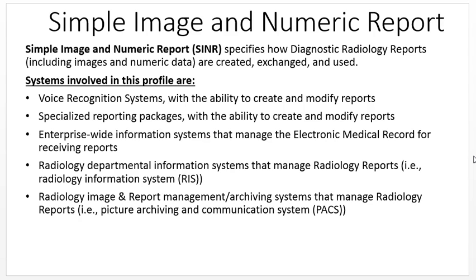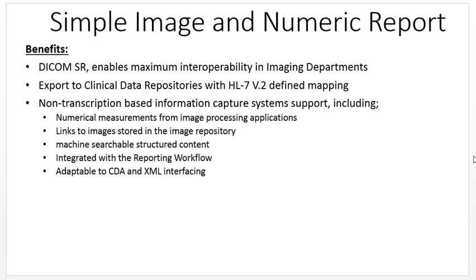Simple image and numeric report defines how diagnostic radiology reports, including images and numeric data, are created, exchanged, and used. Here are the benefits for the simple image and numeric report profile. DICOM SR stands for DICOM Structured Report. It allows you to embed the report as a DICOM image. Some places choose to do that, many do not.